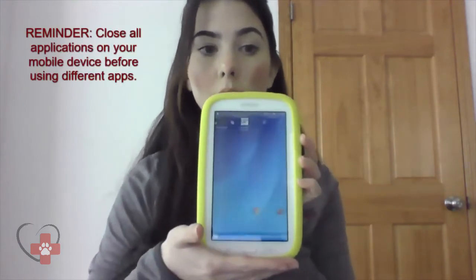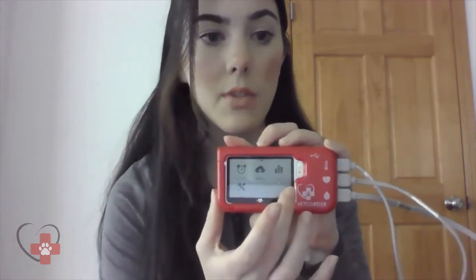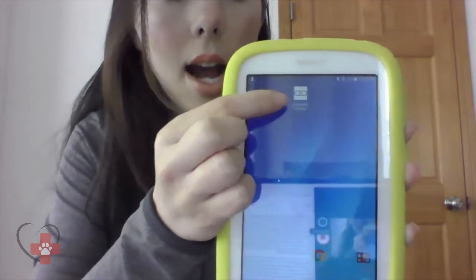To begin using the VetCorder Connect app, I always recommend closing out of all applications on your mobile device. Once you've closed out of all applications, please open on your VetCorder Pro — prior to anything on your mobile device — the upload icon. Please note the upload icon is on the second page of your VetCorder near settings. Once you select upload, you're going to see a Bluetooth icon search out for a connection. Once you see this on your VetCorder screen, we can then go to our mobile device to open up the VetCorder Connect application.